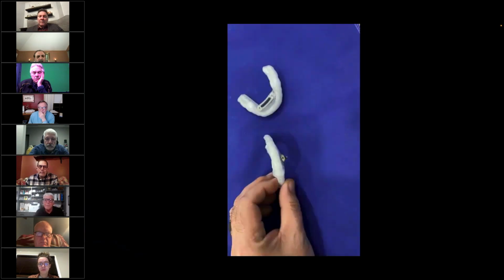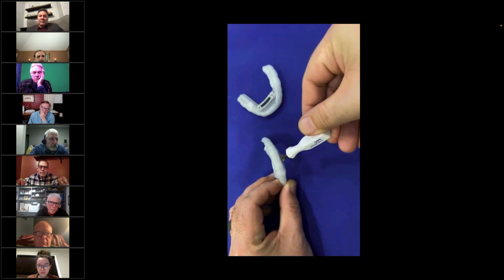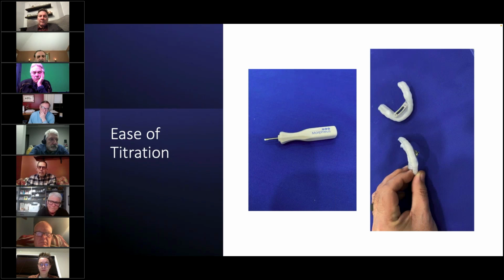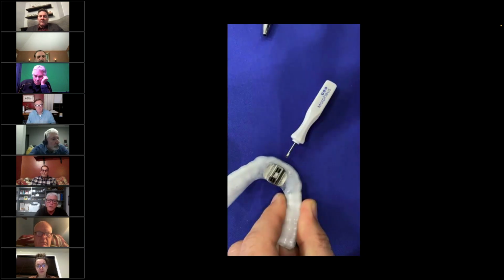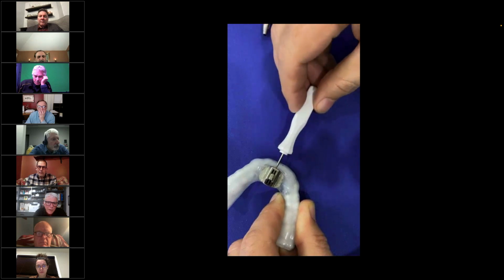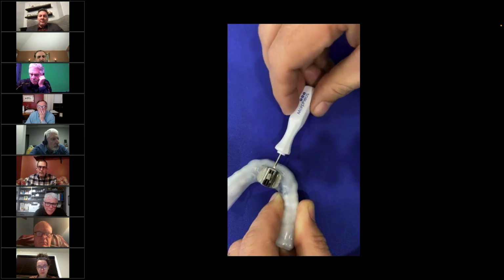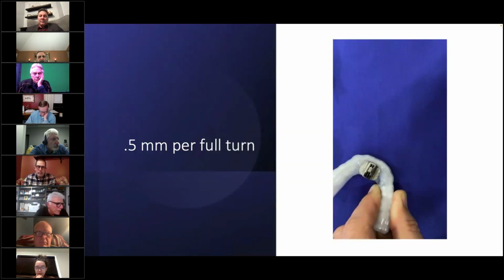So it goes into place. This will be a full turn. That's one full turn. That's a half a millimeter forward. One of the things I like about this is it's very secure. So when we made the key, we made it fit perfectly into a slot. Half a millimeter for a full turn. So we're going to make several full turns here. That's half a millimeter. That's 1 millimeter forward. Millimeter and a half. And 2 millimeters. And there it's marked, and you can follow where the patient is, 2 millimeters.